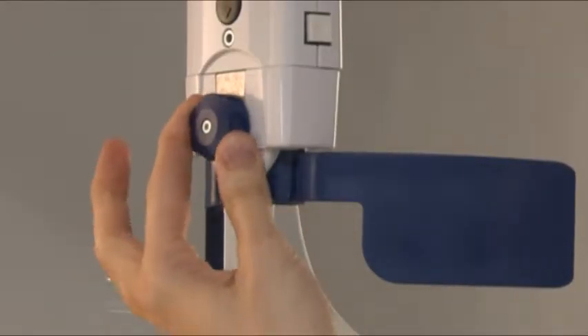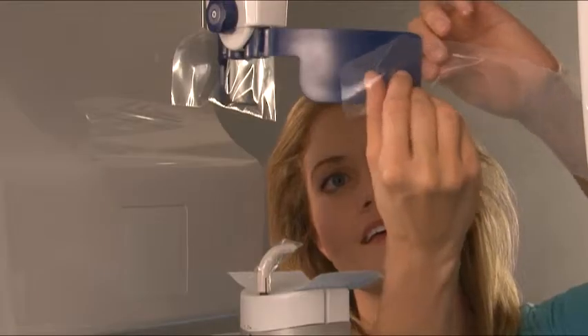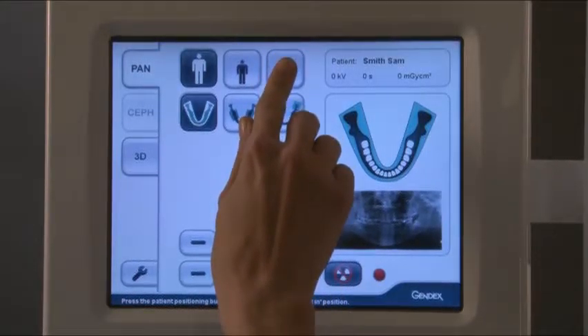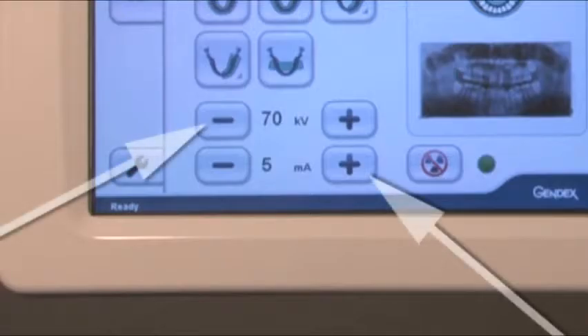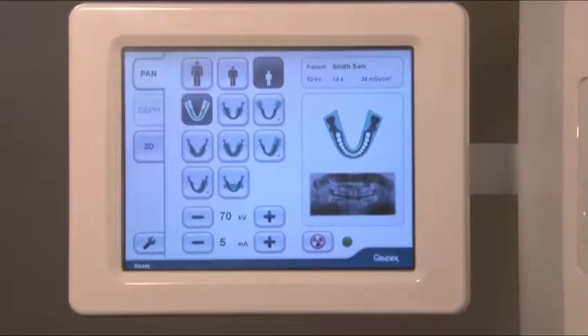Then place barriers on the bite guide and chin rest. Open the head support by turning the knob, then pull the head support assembly fully forward. Place barriers on the head supports. Ensure that the pan tab is selected, then select patient size and the appropriate projection button. Exposure settings are predetermined by the selected patient size and projection; however, kilovolts and milliamps can be adjusted. If small panoramic is selected, the width of the image is reduced.